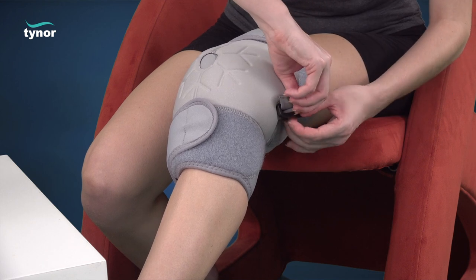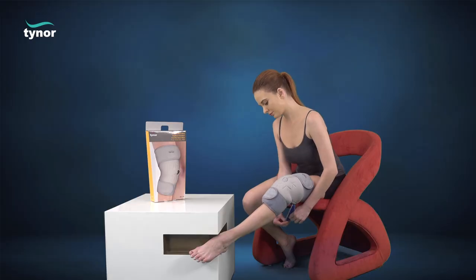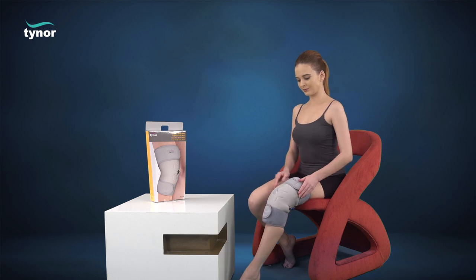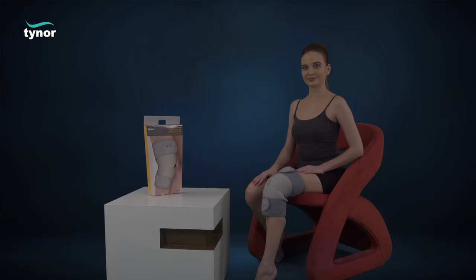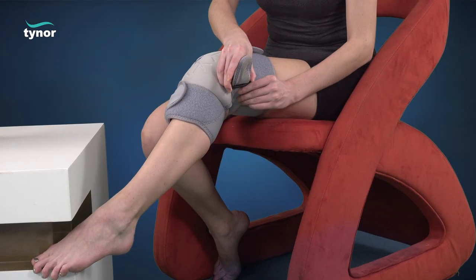Next, apply the middle hook-loop fastener for a snug fit. To remove the cool pack knee wrap, simply unfasten the hook-loop fasteners for easy removal.